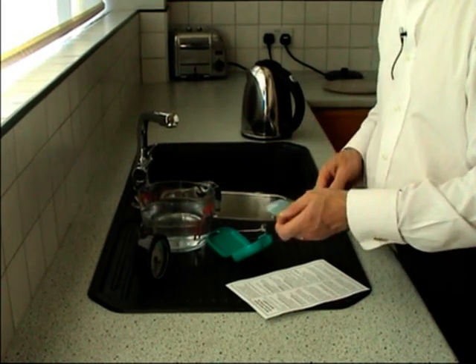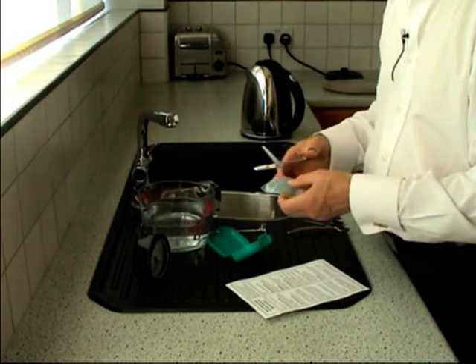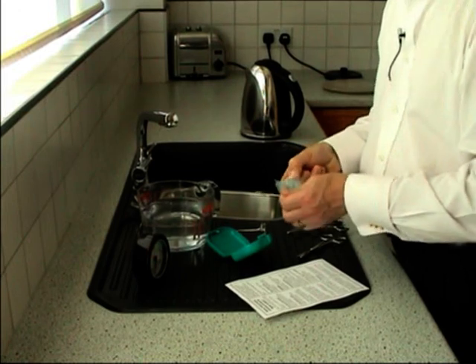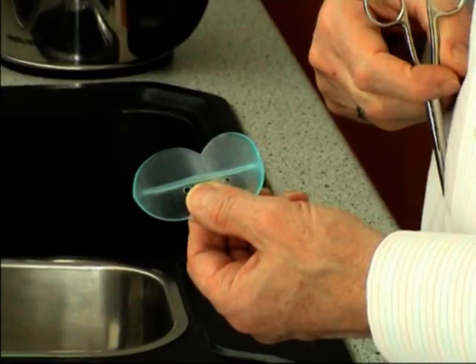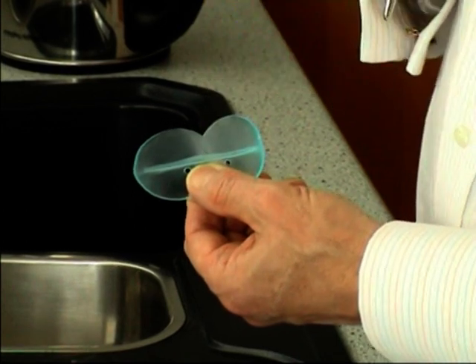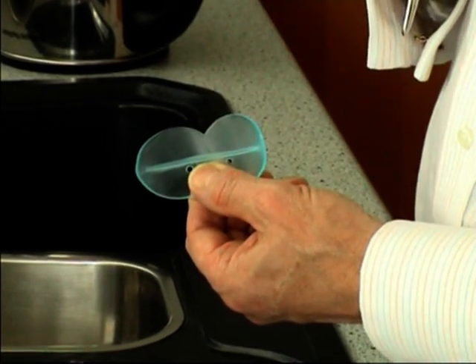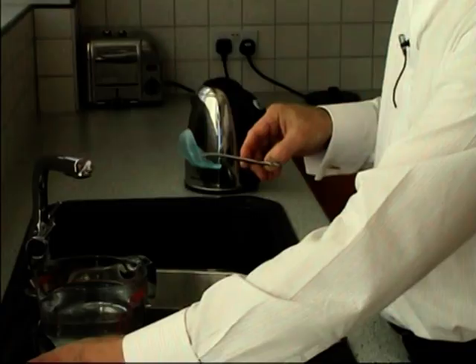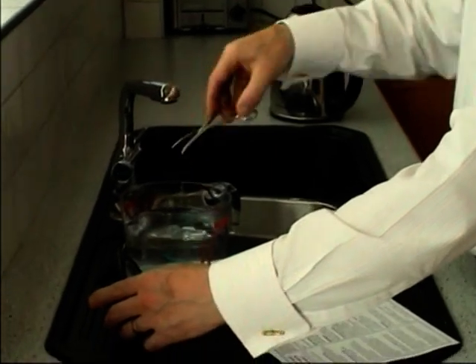The device is going to be popped into the water for one minute. But let's just have a look at it first and make sure we know which way is up. This small arrow here denotes the top of the device. The holes are in the bottom. So we'll pop it in for a minute.